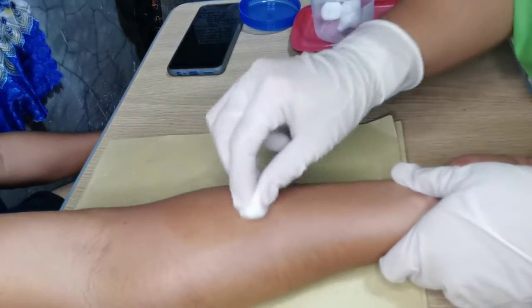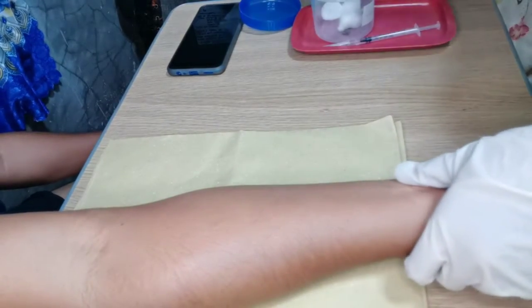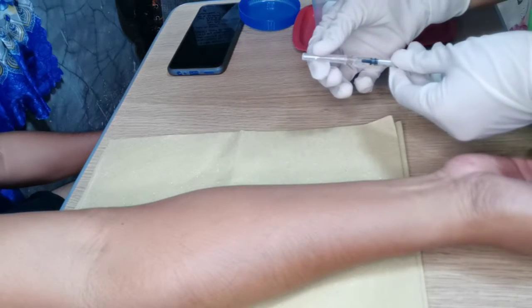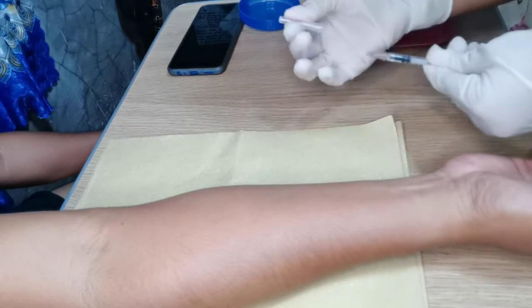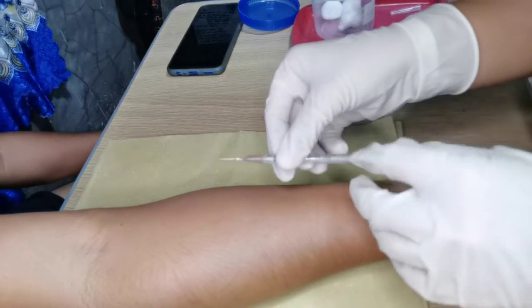Select an appropriate administration site. Assist the patient to the appropriate position for the site chosen. Drape as needed to expose only the area of the site to be used. Cleanse the site with an antimicrobial swab, wiping with a firm circular motion and moving outward from the injection site. Allow the skin to dry.